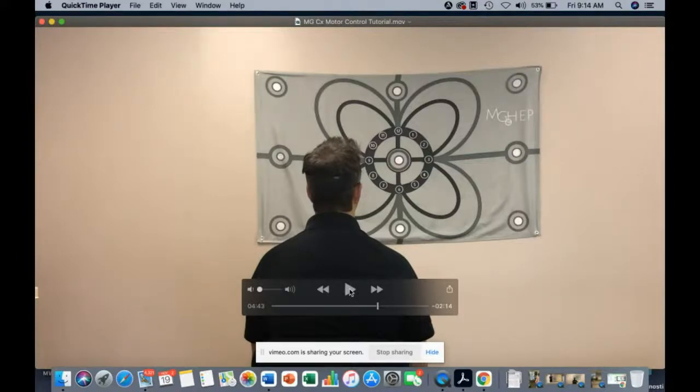So hey, hold the laser in the middle and then look to different targets on these flags. So look to the left center target, the right center target, go in a diagonal, or go up and down. Okay, and you can even do some of your assessment here, which I often do, especially if I'm noticing some small irregularities. I want to know if they're getting a motor cheat with their saccade side to side.